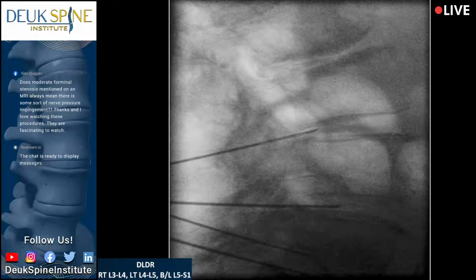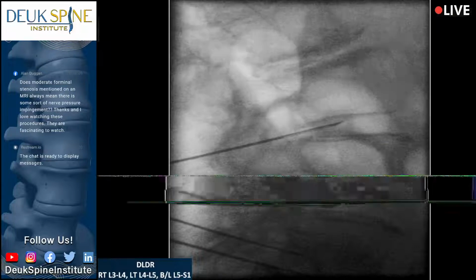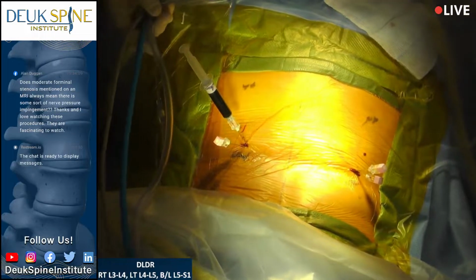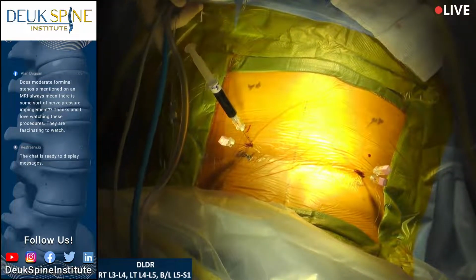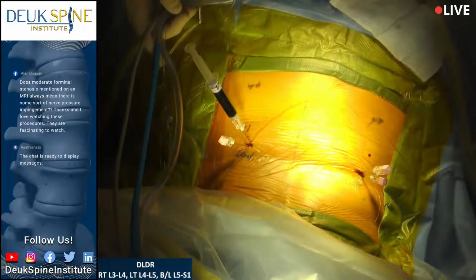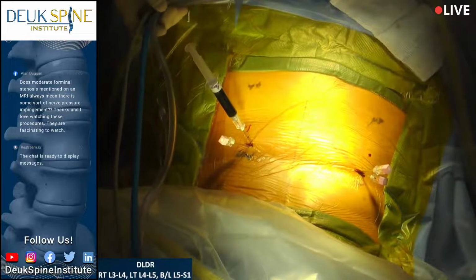You okay? She's got humongous tears in her disc. Humongous. I mean, that thing just went right in. Yeah, it's better, but it's still a bit dark. I think what is going on is it's picking up at least the bowel gas pattern. Yeah. All right.